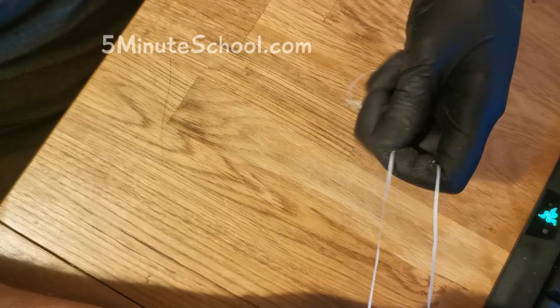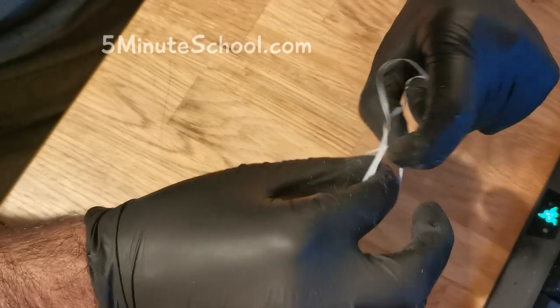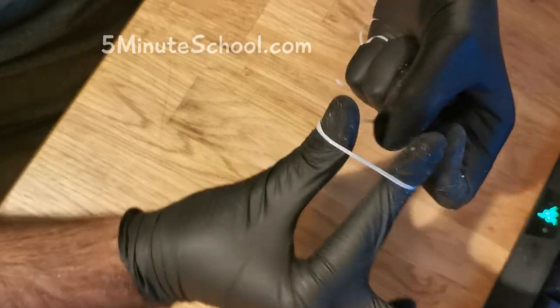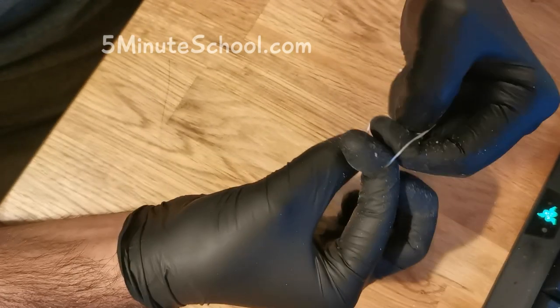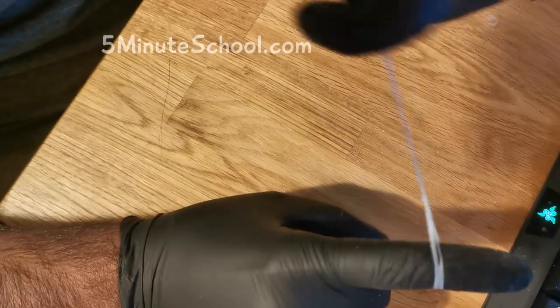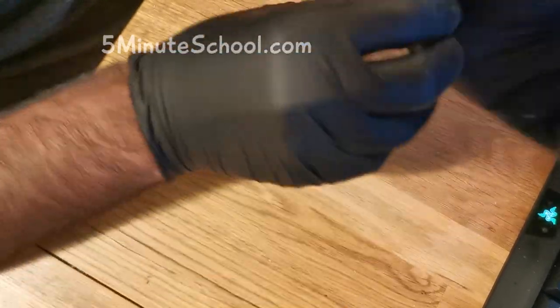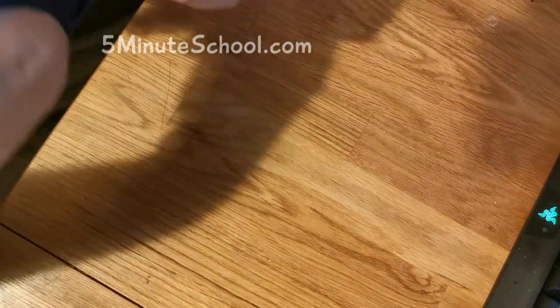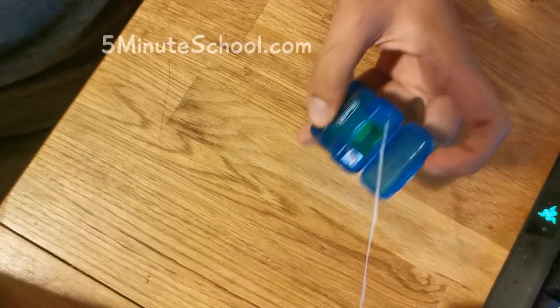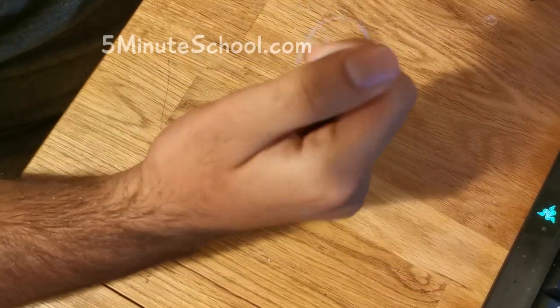We grab the piece of floss like this. Alright, so that's how it's done. I'm going to show you now — I'll take these gloves off and show you how to do it. So we take our piece of floss like so. Remember I said about 15 to 20cm.